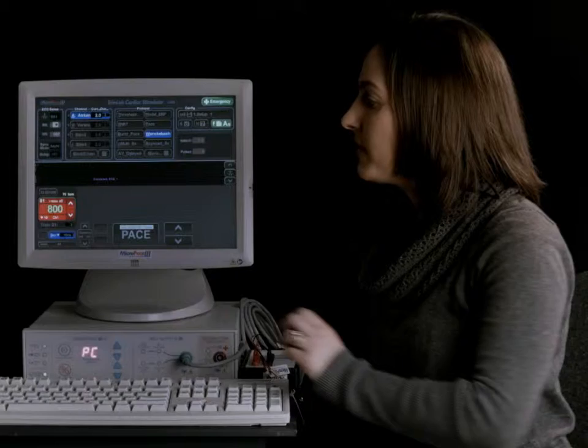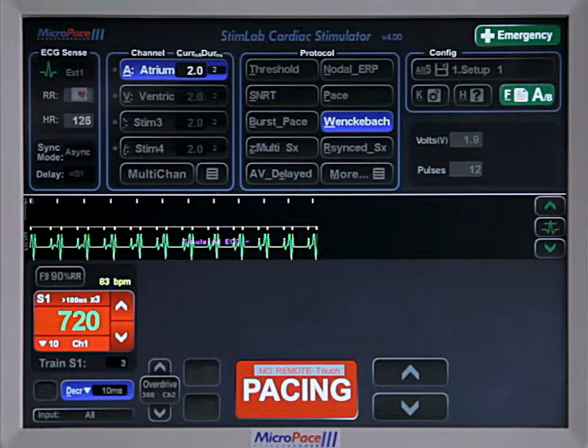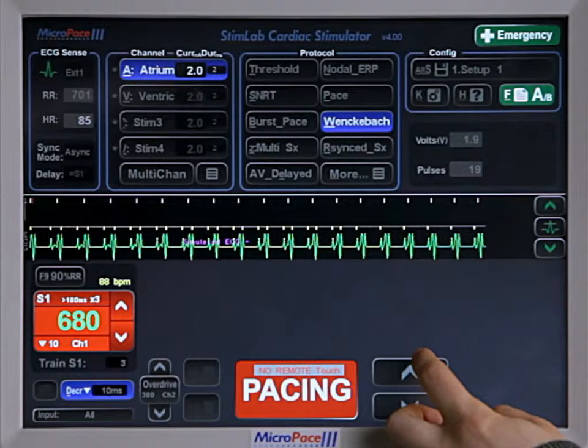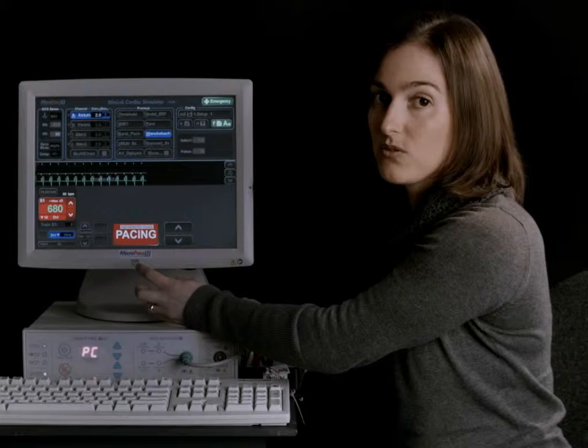So we'll start pacing there. It will start by decreasing by 20 milliseconds, and as you get a shorter S1 you'll also get a shorter decrement in the milliseconds as well. So now let's say that you see block — you press the increase button and it will hold, going up by one and then holding the pacing at that interval.